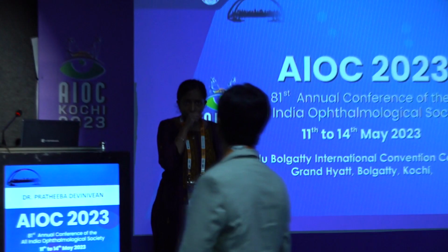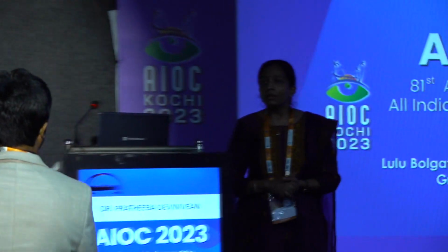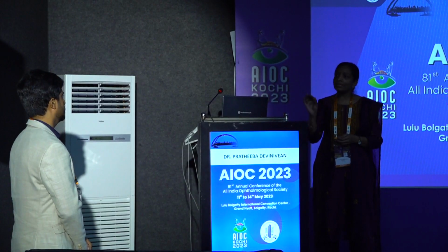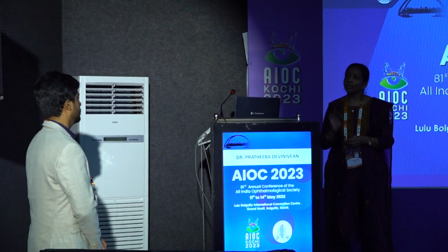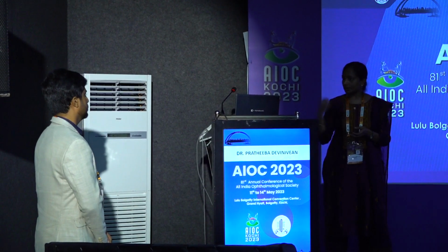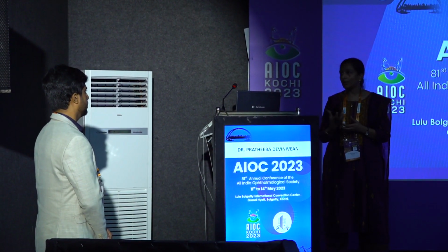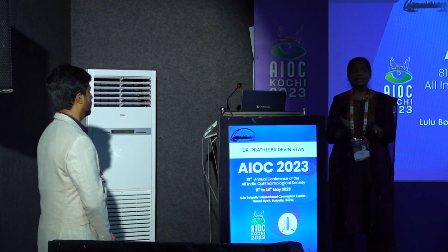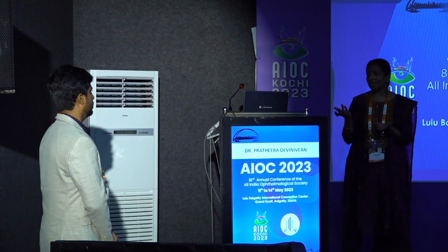What data do you have to send to the company? Only they ask for the DICOM data. We have to specifically tell the radiologist to give the DICOM data of the CT images. Then there is a technical person who makes the STL models. If we hand that over, they will give the model. It's just like a skull model, that's all, nothing different.